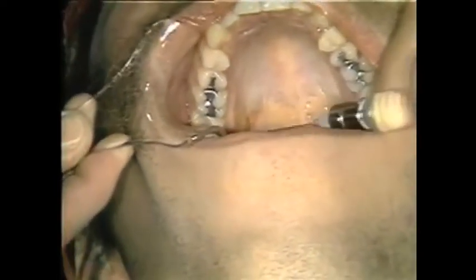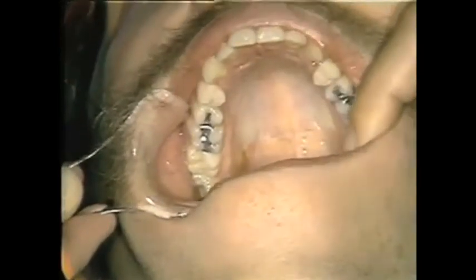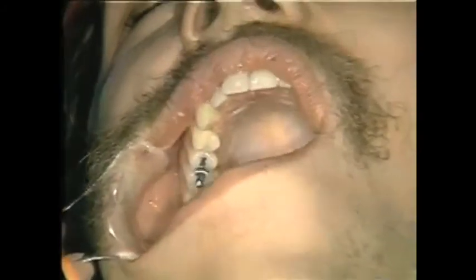And once again, this will anesthetize all of the palatal soft tissues from third molar up to approximately the cuspid area where it anastomoses with the nasopalatine nerve. We'll let you close for just a moment, Eddie.